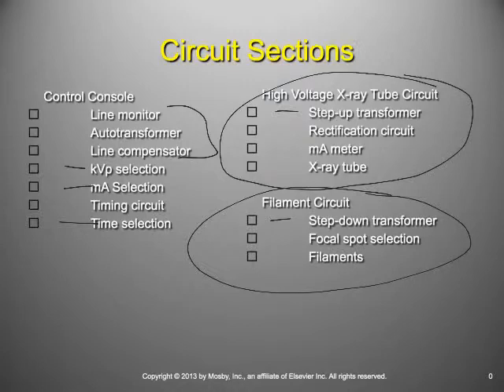And the way these filaments work, basically what we're talking about is a space-age toaster oven, right? When you push down the button on your toaster and the filaments start to glow, that's exactly what's happening inside the X-ray tube. When your toaster filaments are glowing, they're doing what's called thermionic emission. They're emitting electrons and heat, primarily heat. They're boiling off electrons, and that's making heat energy.